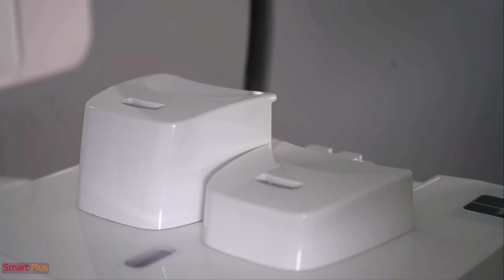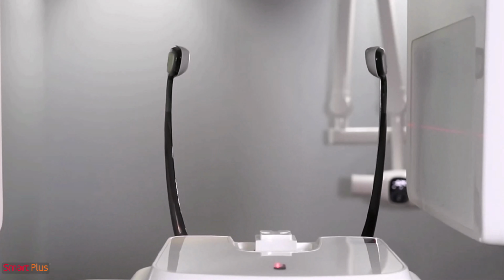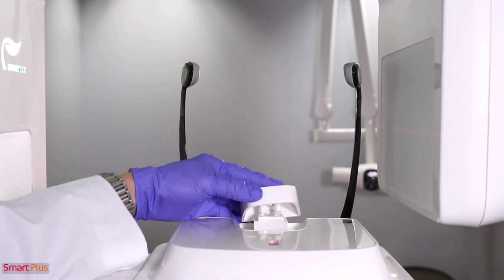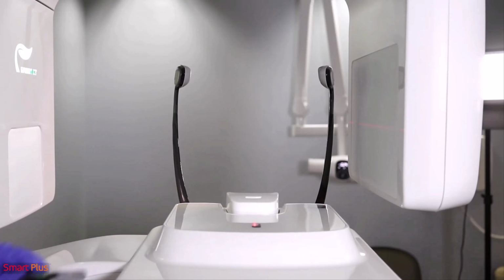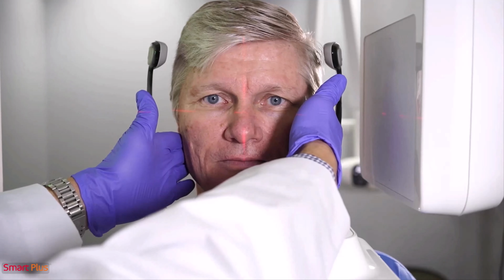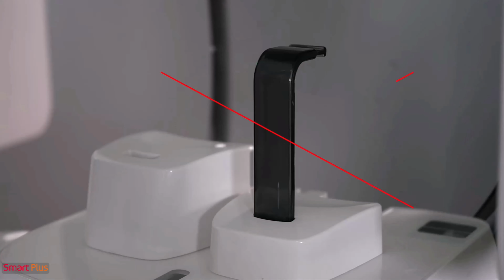Notice the 2 different size chin rests that are included with your machine. Be sure to use the smaller chin rest for this example. This combination is used when it is clinically necessary to capture additional superior into the sinus. Note, the inferior border of the mandible will not be captured when using this combination. Also, it is not possible to utilize the regular bite stick with this shorter special chin rest.